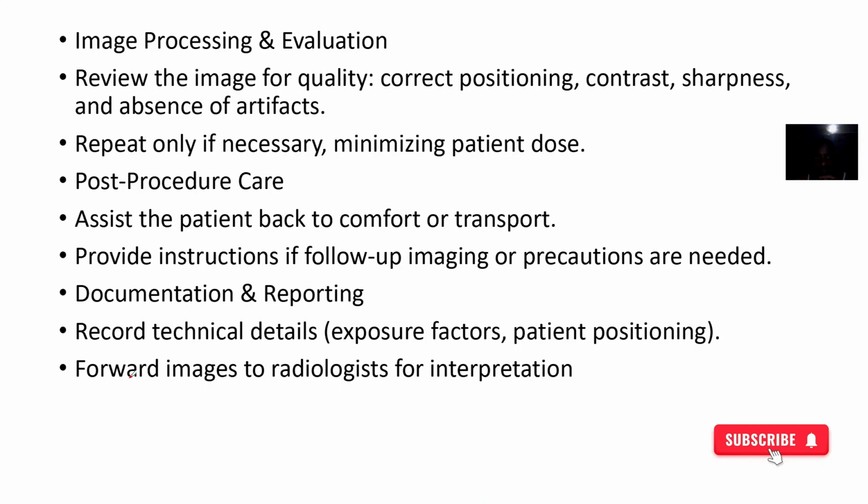Okay. So imaging process and evaluation: you review the image for quality and ensure that everything is okay and can be used for diagnosis before you send this patient back. Then repeat it only if necessary. And of course, you have to be careful from the onset to avoid these repetitions.